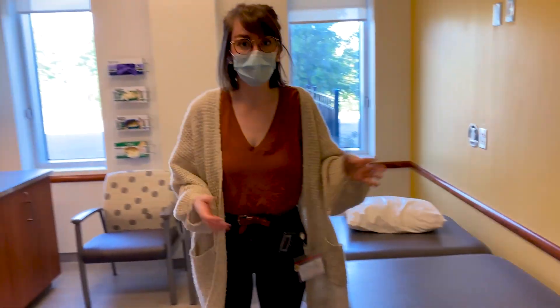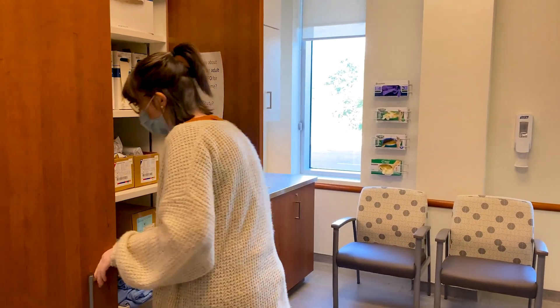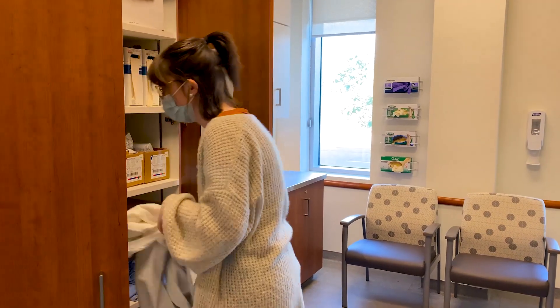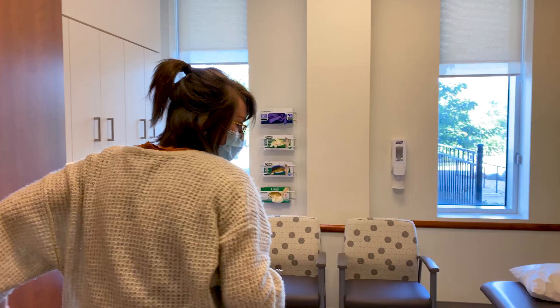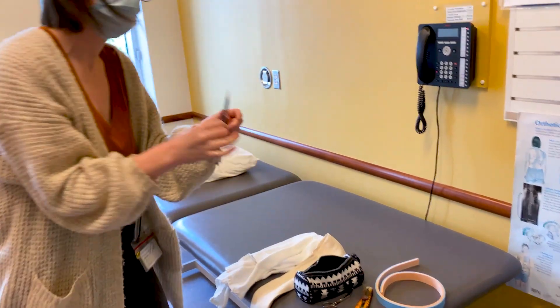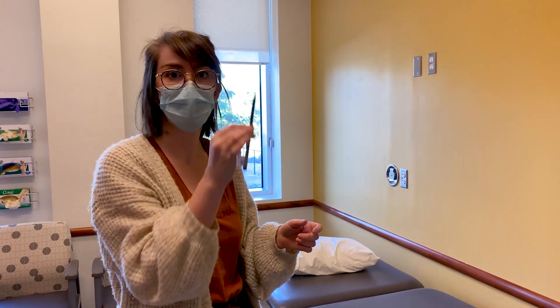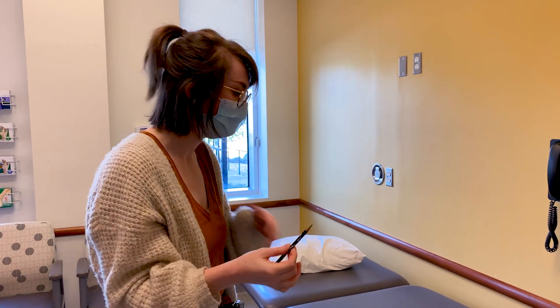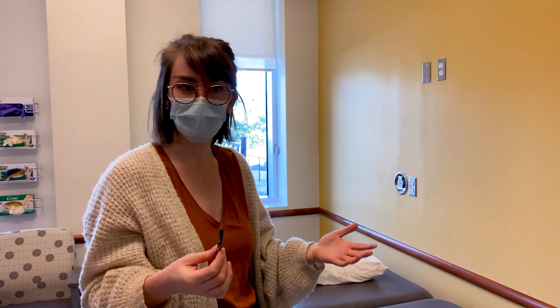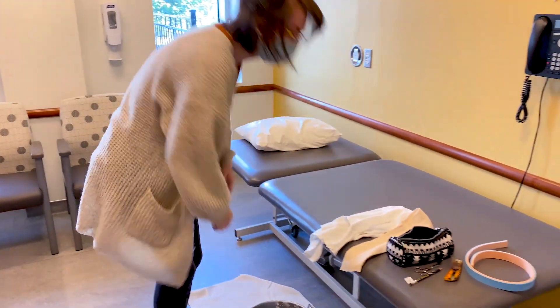When I come into the room I just get ready to cast. I put down some towels to keep the floor and myself clean. This will go on her skin, and then I use my indelible pencil with some water — it makes a really nice bright purple mark. I can use that to mark any bony prominences, anything I need to remember when I'm modifying her cast.